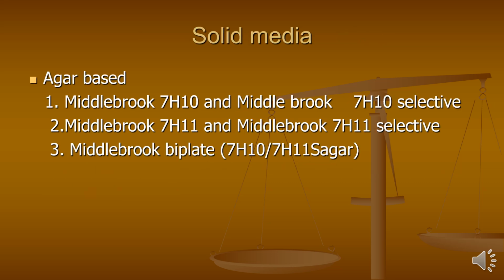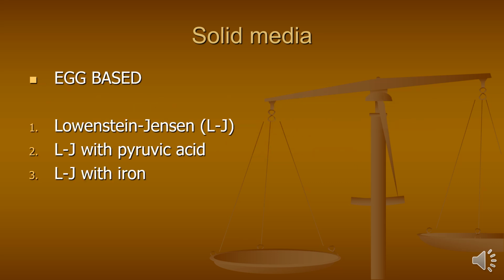So what are the media which we require? Agar-based media are Middlebrook media, which are Middlebrook 7H10 and Middlebrook 7H11, and Middlebrook biplate. Egg-based media are LJ media with pyruvic acid and LJ media with iron.